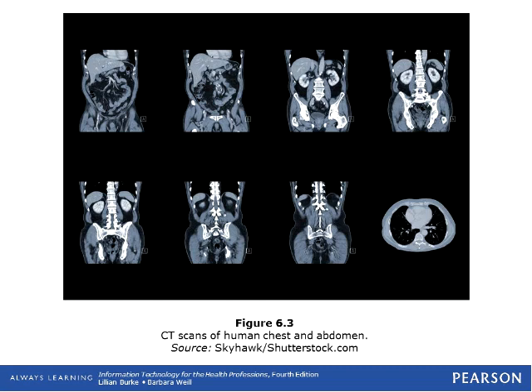This is a CT scan of the human chest and abdomen. A CT takes different pictures and layers them in, so it goes in 1 centimeter, 1 more centimeter, 1 more centimeter, and we're going deeper into the human body. Here's a more superficial look. This is a much deeper look, and we start to move in.